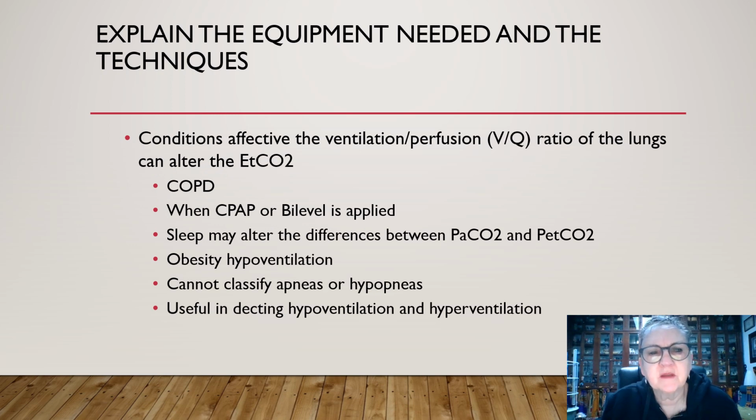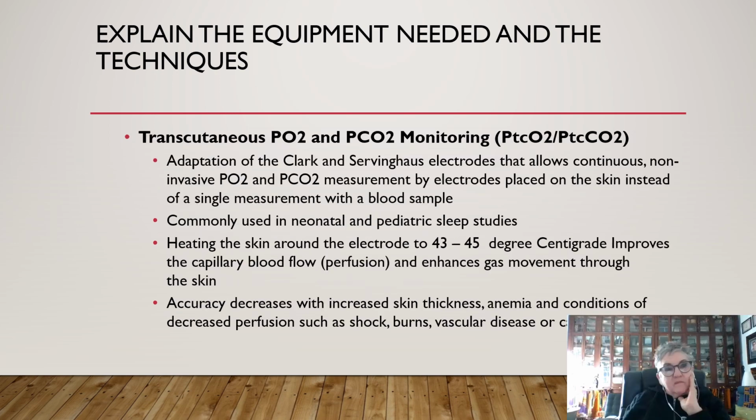There are conditions that can affect the end-tidal CO2, such as the ventilation perfusion ratio of the lungs, COPD, and when CPAP or bilevel is applied. Sleep may alter the difference between PaCO2 and end-tidal PCO2. Obesity, hypoventilation: it cannot classify your apneas or hypopneas, and it is used in detecting hypoventilation and hyperventilation.